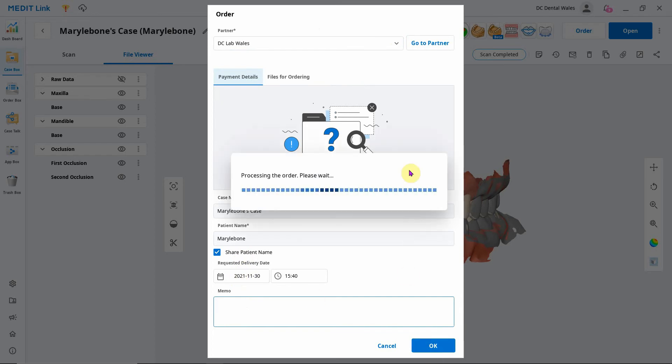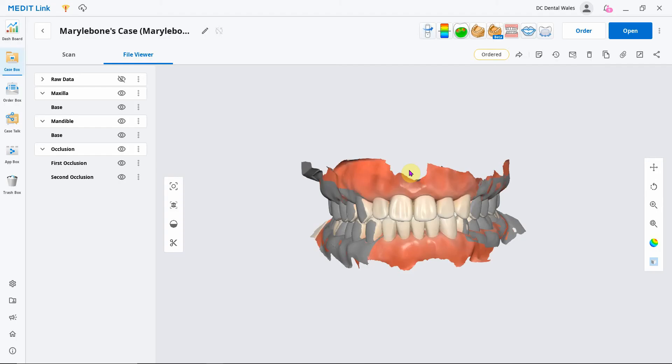It will send the order. All done. The stage has gone to order and the status has gone to order there. I hope that helped. Give me a shout if you need anything else. Thanks.